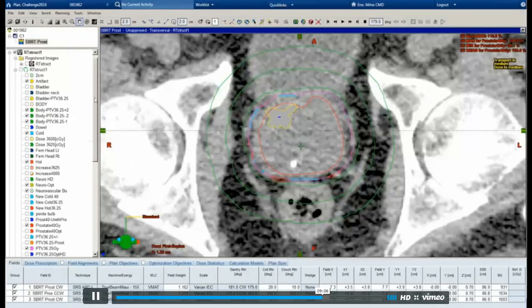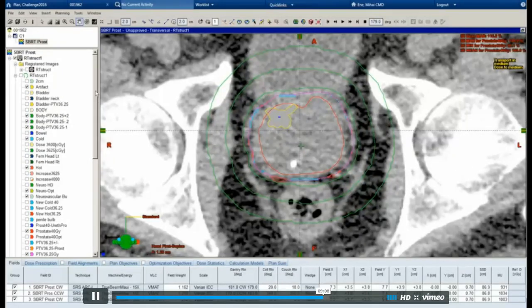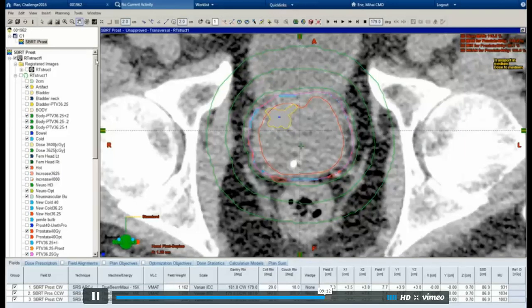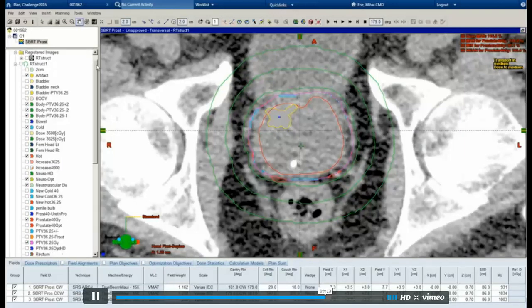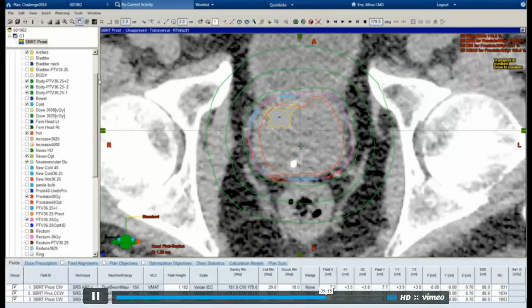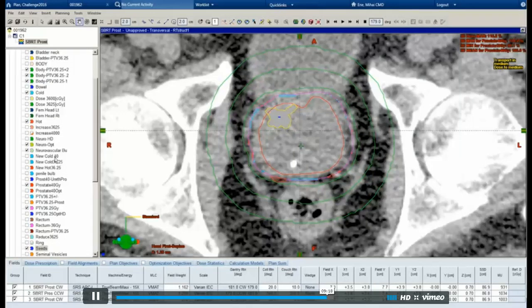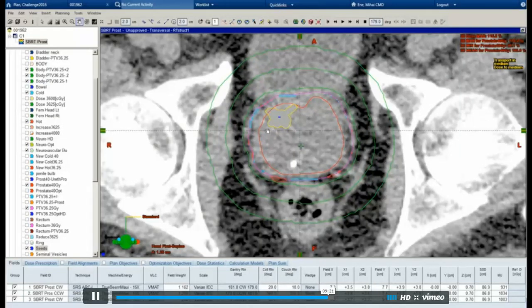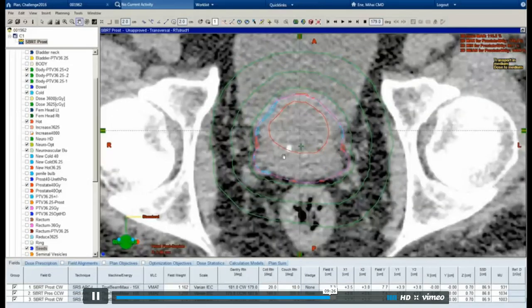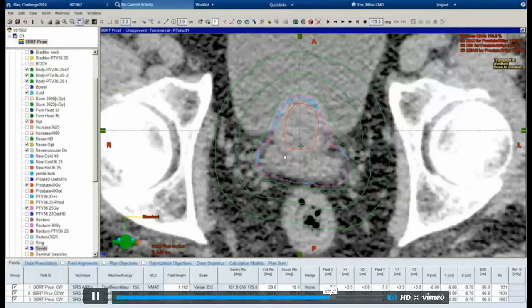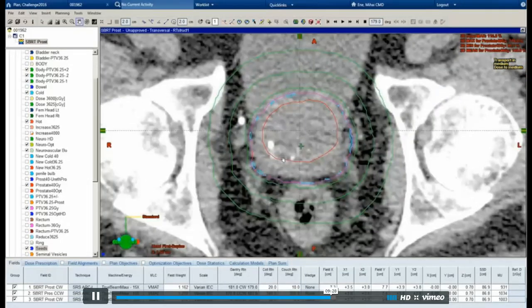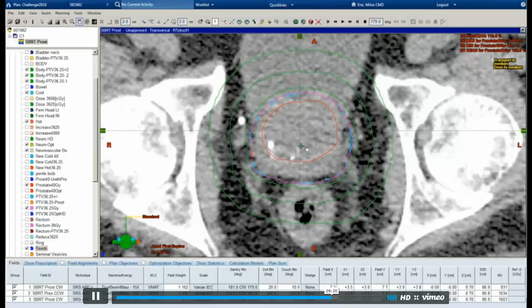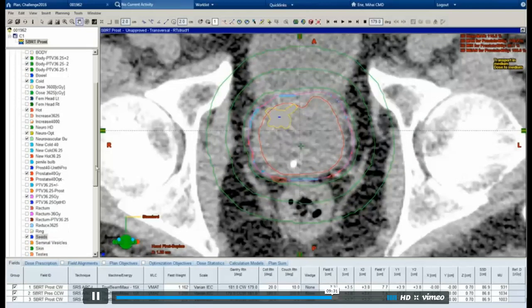And you would use that in conjunction with your NTO? I do, I do. But in this case, I just use the NTO and my hot and cold structures. The thing with the hot and cold structures is that they're very time consuming to brush up and you have to make them after every calculation because they pop up in different places and they're on every single slice. I did it a couple of times and then, you know, I had enough.